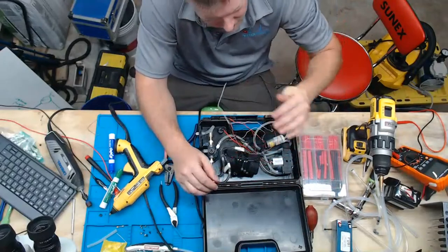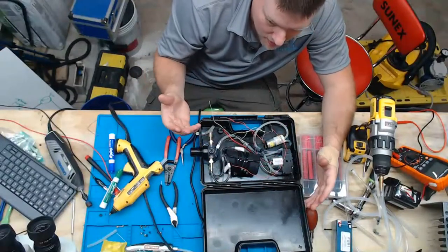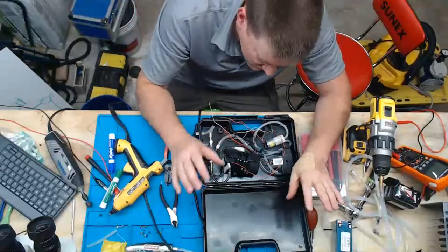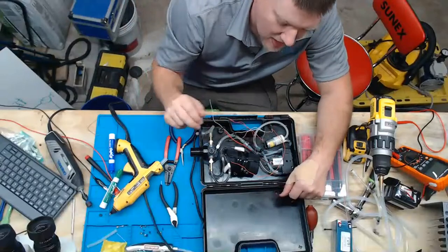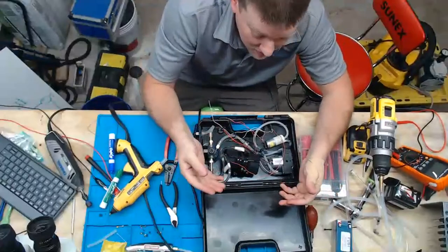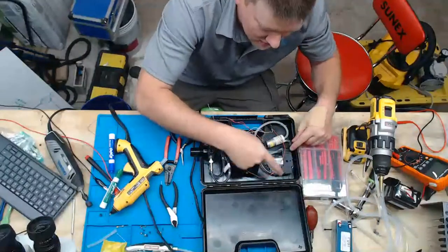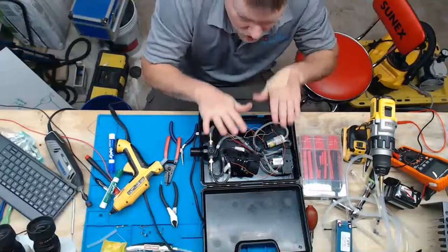I was thinking, okay, I've got different types of air compressors, from non-invasive blood pressure monitors, maybe from pneumatic tourniquets. And so I started looking at them, and I found both of these ones. They're both 6-volt motors. And then I wanted to check the overall pressure to see just how much pressure these types of pumps kick out, because they use a different technical pumping mechanism. One of them is a back and forth piston, and the other one is a rotary.